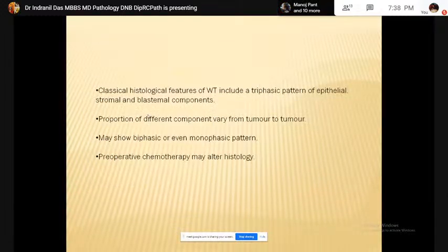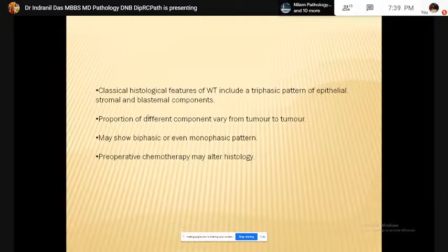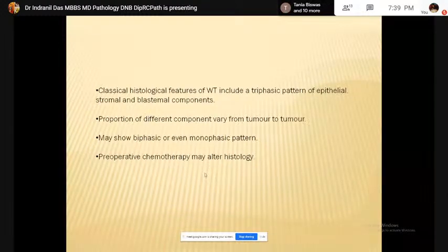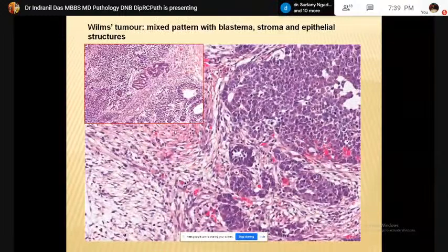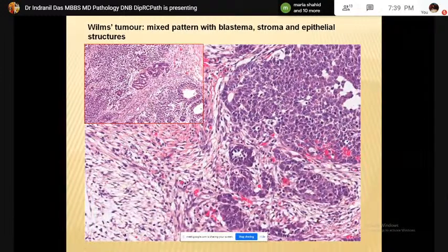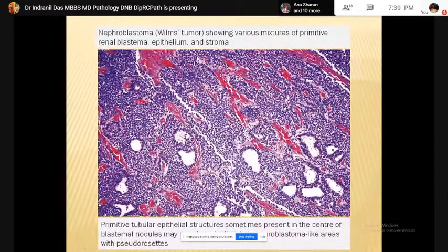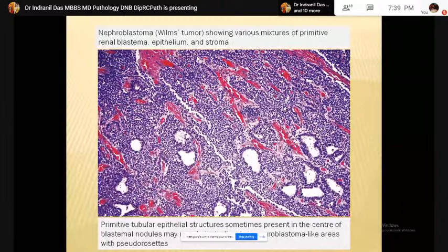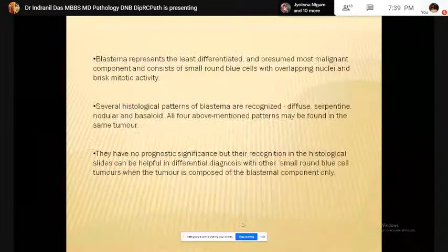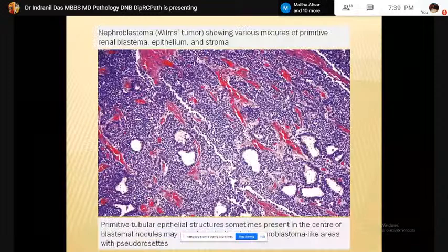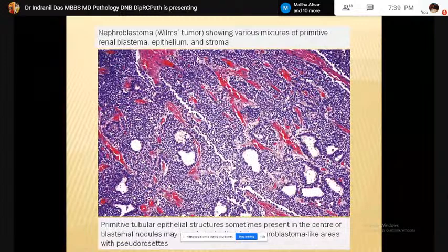The classical histological features of Wilms tumor include a triphasic pattern of epithelial, stromal, and blastemal components. The proportion of different components may vary, or it may present as a biphasic or monophasic pattern — in that case, diagnosis becomes difficult. Preoperative chemotherapy may alter the histology. This is a classical Wilms tumor with a triphasic pattern: these are primitive tubules, these are blastemal cells, and this one is mesenchymal structure. This is another picture of biphasic tumor with tubules and blastema.